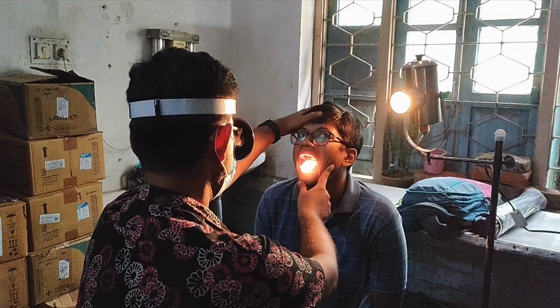Another important thing: although in this room the ambient light is quite a lot, preferably it should be a dimly lit room so that the light reflected from your head mirror is highlighted more. So let's progress.